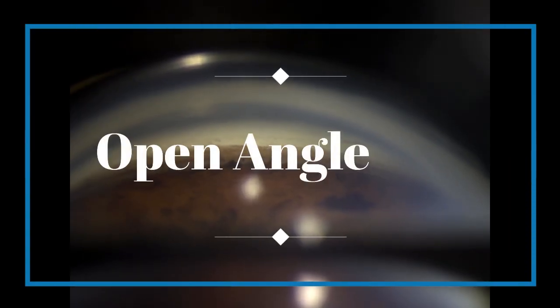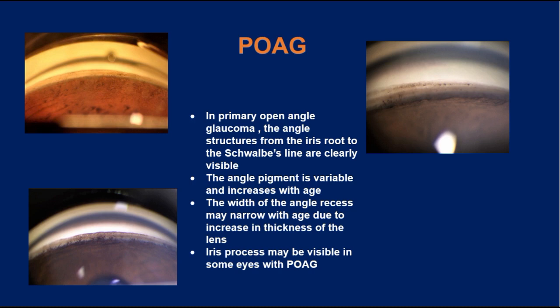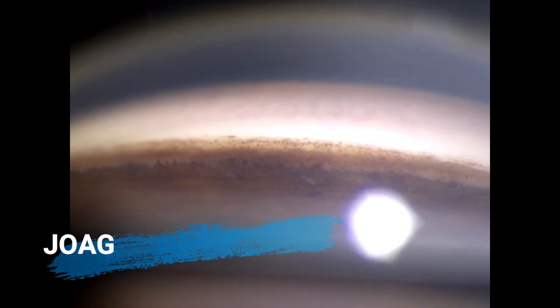In open angle glaucoma, we commonly encounter primary open angle glaucoma, where we see all the structures from iris root to Schwalbe line. Angle pigmentation may be seen, variable with age. Sometimes even iris processes may be visible. In cases of juvenile open angle glaucoma, we see an open angle and along with that we may see prominent iris processes.